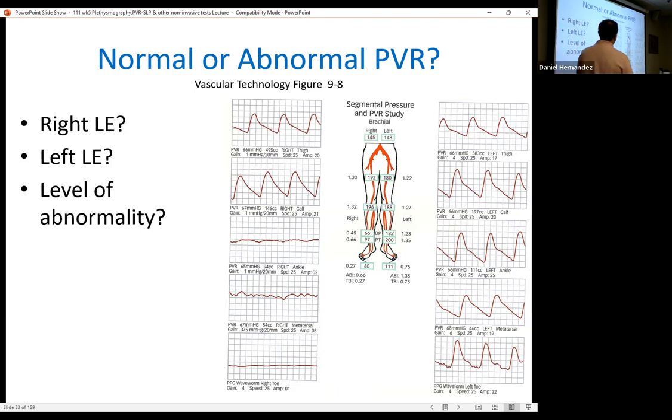That sucks. Well, we're thinking about arteries, so wouldn't it be like the tibial artery maybe? Or the front one, the anterior tibial. Yeah, but over here on the left, is that the toe? Okay, so maybe the toe would be different. But on the left toe, I feel like that is a much sharper waveform than that one. Does that make a difference or no?